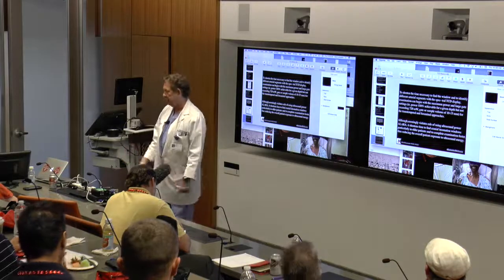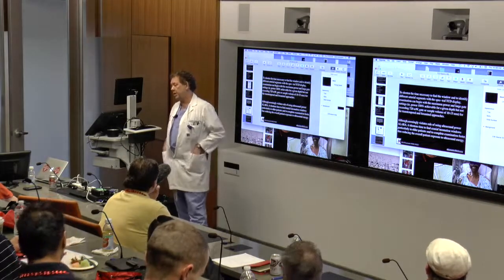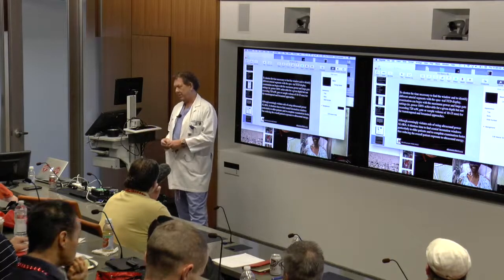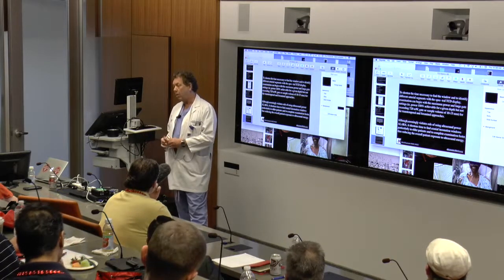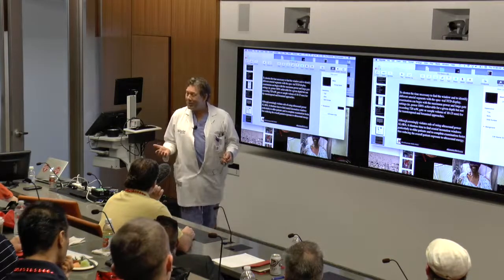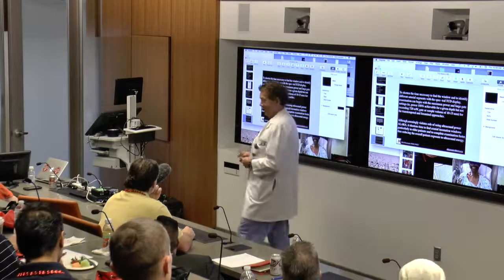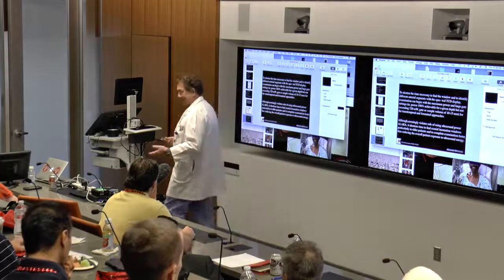And that's part basically of trying to persuade people that this is a good thing to do and that it's practical. I mean, I can't just implement this tomorrow. And that's why we kind of walk through this. Is it good to know where your head is being perfused when you're on cardiopulmonary bypass? Hard to dispute. That's not a bad idea. Now, how do we get there?